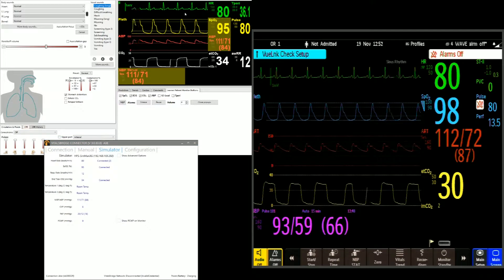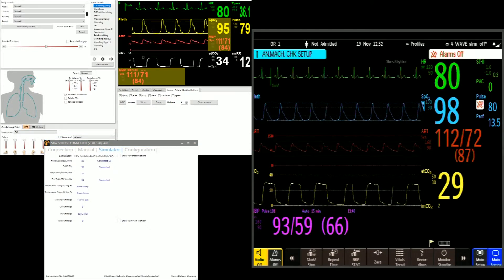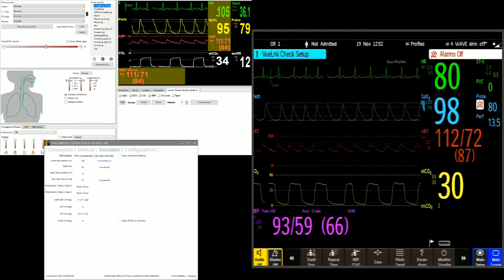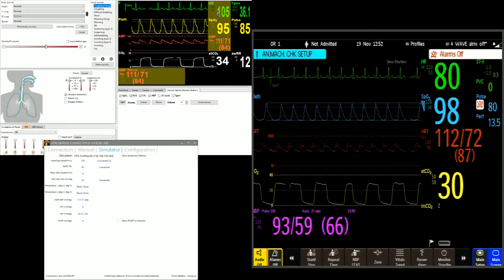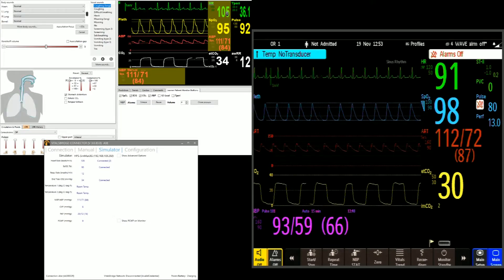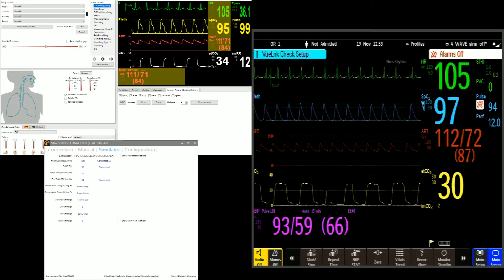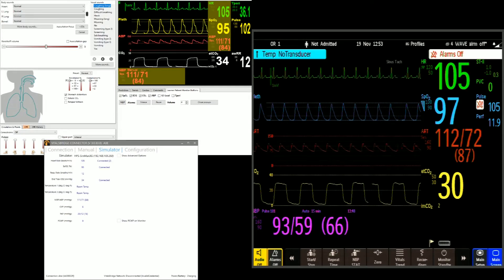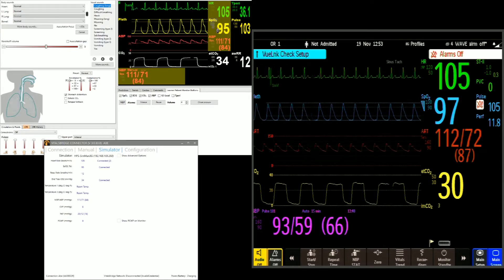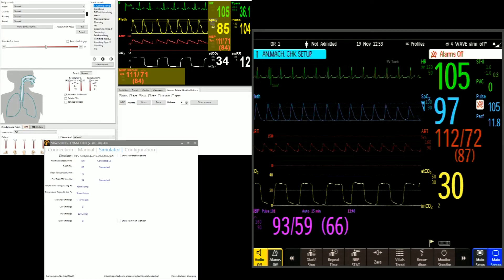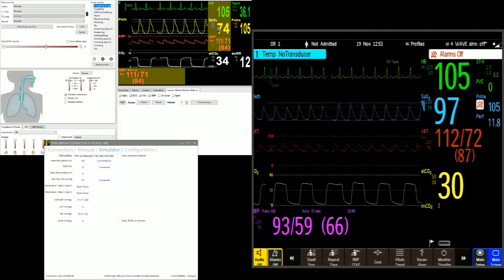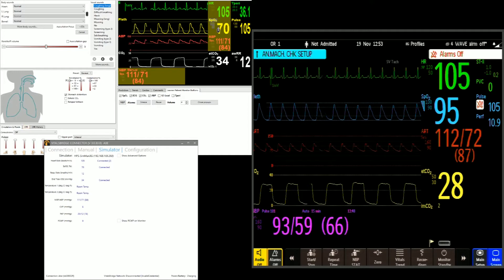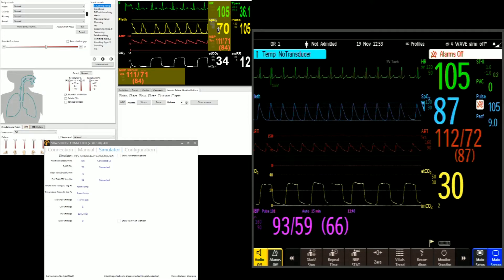We'll start with heart rate and change it from 80 — we're going to quickly change it to 105 beats per minute. I'm adjusting that through the window. Take a look and you'll see that this set value in LEAP is now 105, where it used to be 80. Now the patient monitor is updating its heart rate from the increased ECG waveform. We're also going to drop the SpO2 in a similar manner — adjusting it down in LEAP to 70. We'll see that the patient monitor, the Intelliview, is tracking that pulse oximetry value dropping lower.